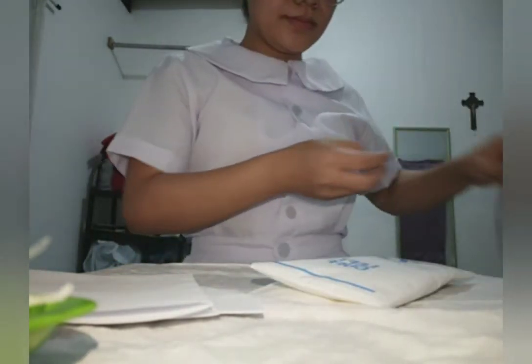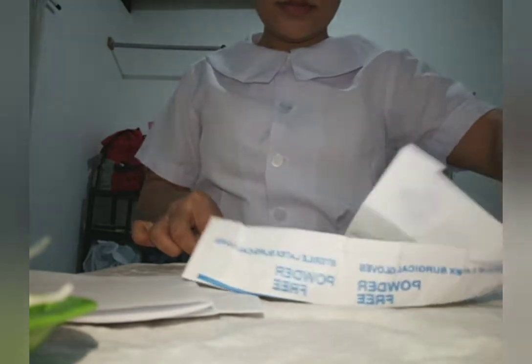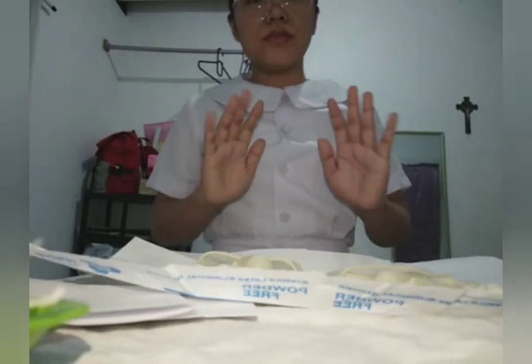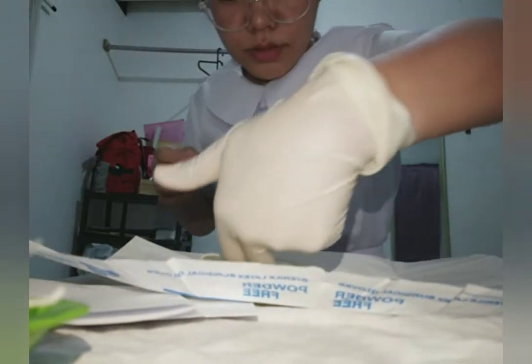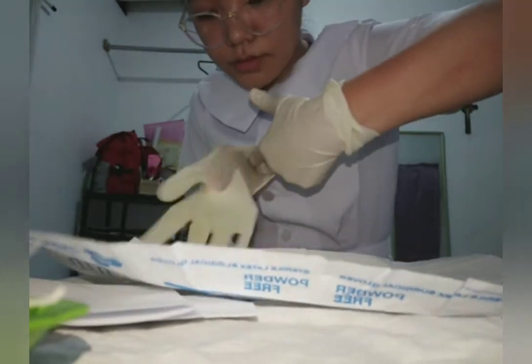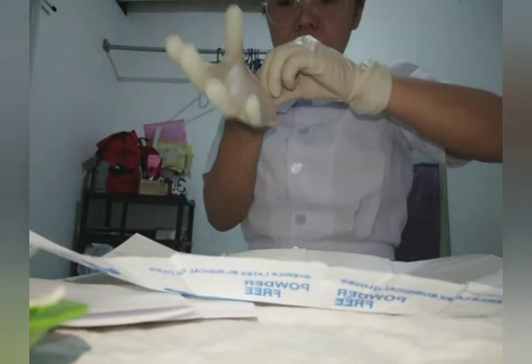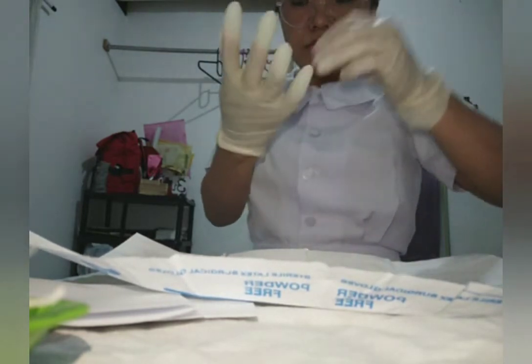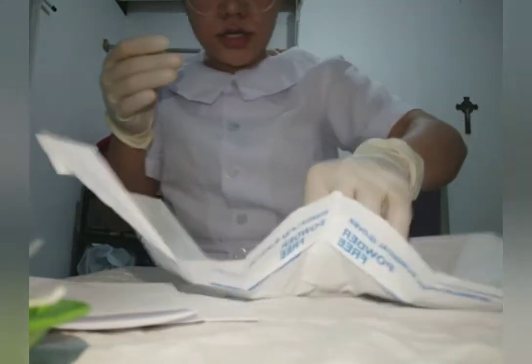First of all, I will put the glove on my dominant hand, that is my right hand. And with the help of my dominant hand, I will put on my non-dominant hand, that is my left hand. I will discard this paper.